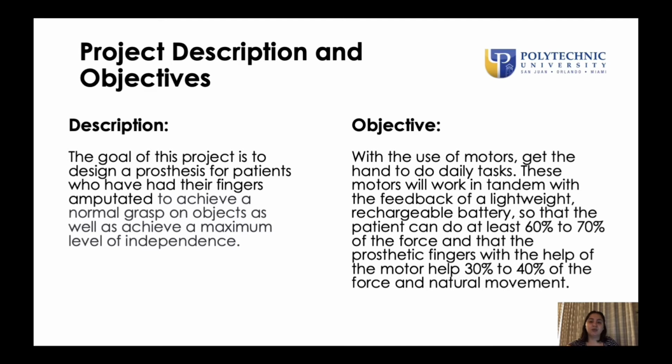Objective: with the use of motors, get the hand to do daily tasks. These motors will work in tandem with the feedback of a lightweight rechargeable battery so that the patient can do at least 60 to 70% of the force, and the prosthetic fingers, with the help of the motor, help with 30 to 40% of the force and natural movement.